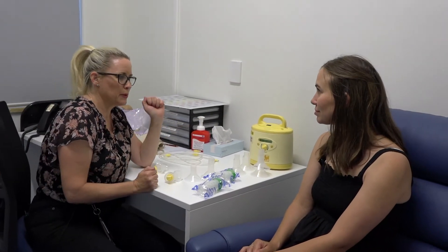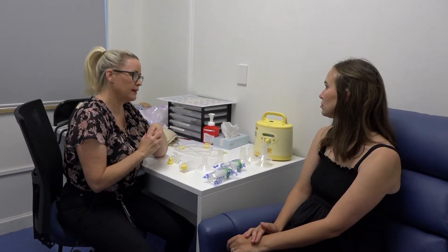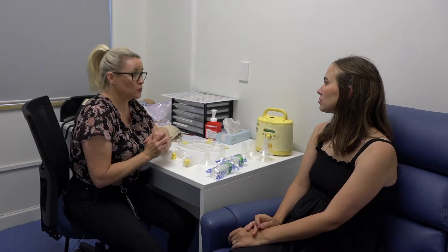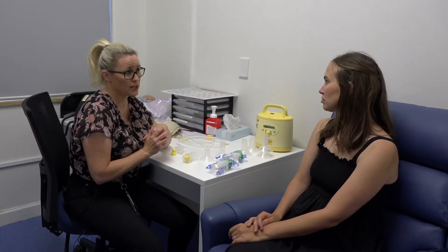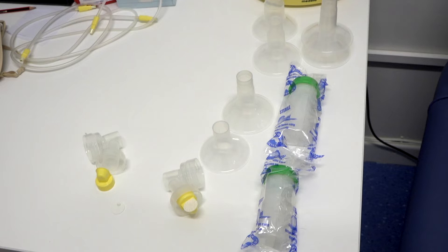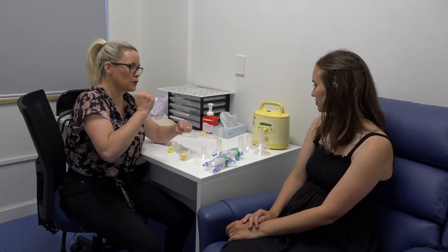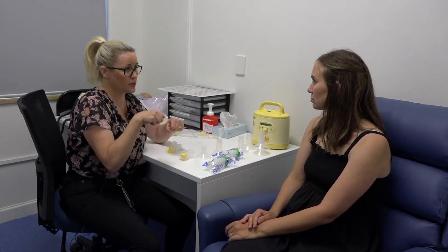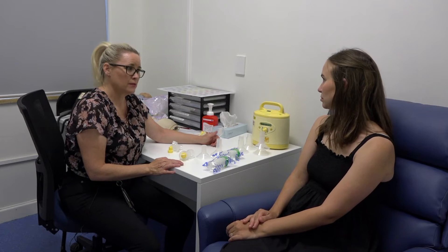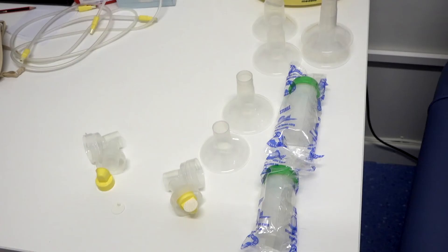Just a little housekeeping: we do need to make sure that we clean all of our equipment after every use. The only bits of equipment you won't need to clean — because they're not coming into contact with any breast milk — are the caps, membranes, and tubing. All the other equipment needs to be cleaned after every use with hot soapy water: give it a good scrub with a detergent and a bottle brush, rinse all the soapy water off, and place it on a clean towel. It takes about an hour to air dry, so clean it as soon after use as you can so it's ready for next time.